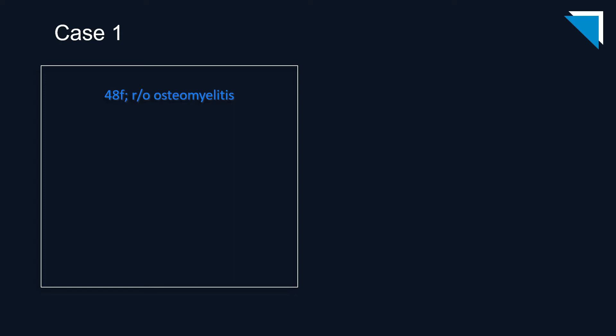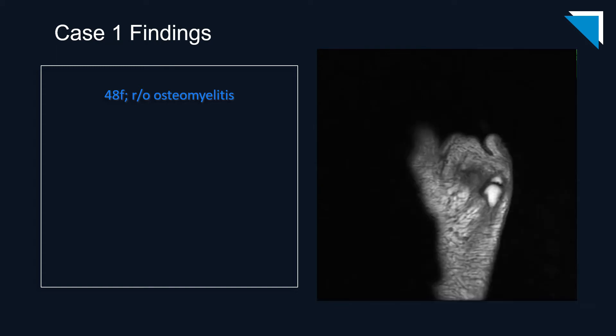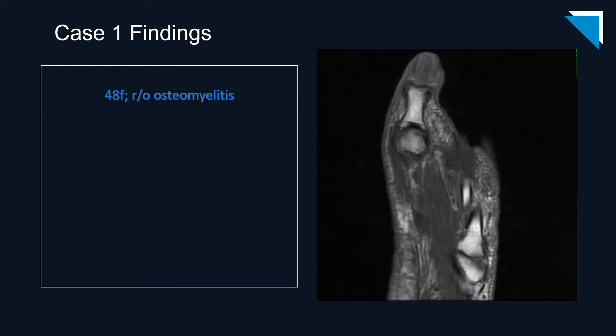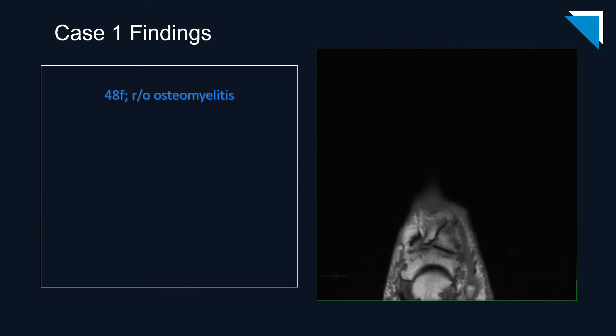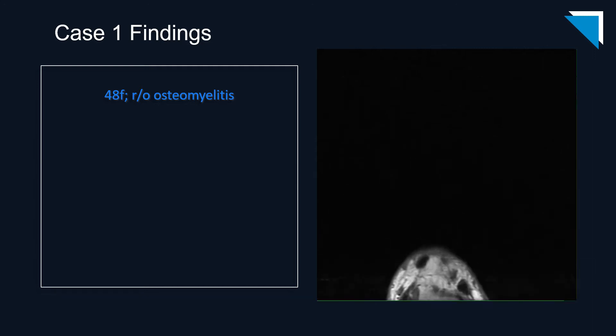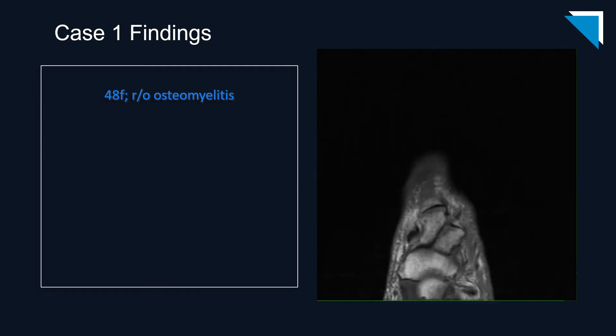With that, let's move on to some cases. Our first patient is a 48-year-old woman who arrives with a history of rule-out osteomyelitis. I tend to start with the axial and occasionally the sagittal non-fat suppressed T1-weighted sequence to get an overall picture of the bony findings.